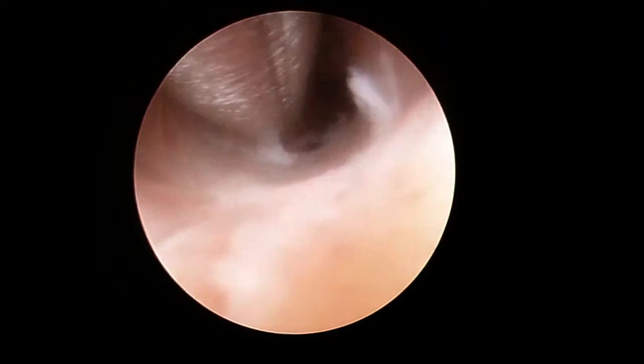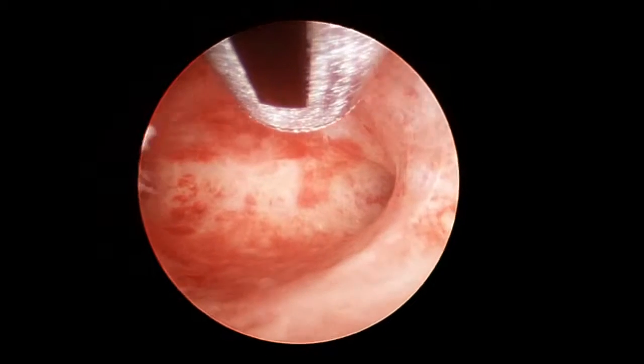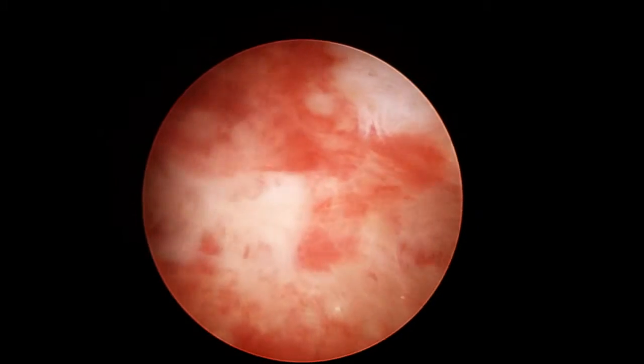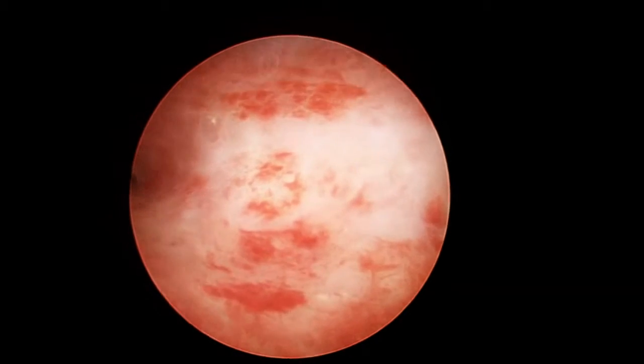Surgical correction of intrauterine adhesion has been successfully completed hysteroscopically using scissors and electrocautery, resecting loops or tips. Complications can include uterine perforation and reformation of adhesions due to additional endometrial damage related to cautery effect. The goal of the hysteroscopic treatment of intrauterine adhesions is to dissect and remove the adhesions to restore the cavity to normal with minimal injury to the endometrial surface. By eliminating cautery and dissection into the myometrium using the MyoSure device, it is possible to reduce the likelihood of adhesions reforming post-procedure.